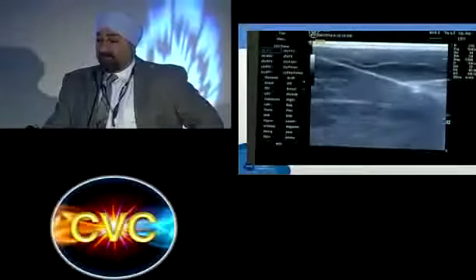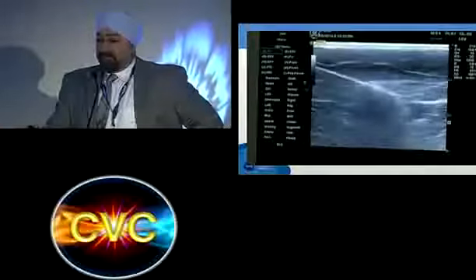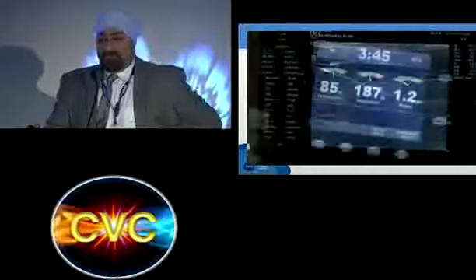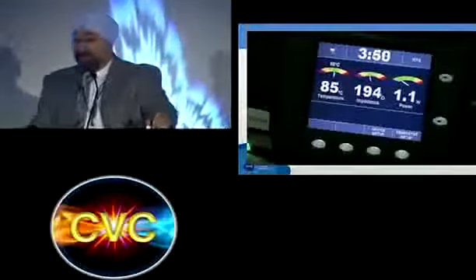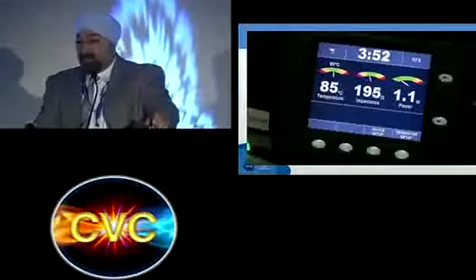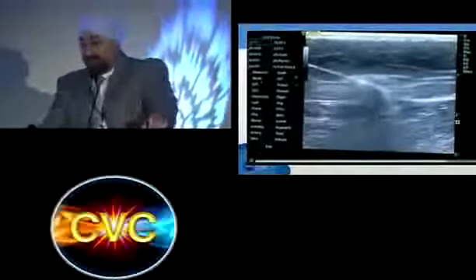Occasionally, if there are branches around it, I'll foam them at the same time, but not today. We'll just ablate this for now. You can stop there, please. So as you see, we're starting to reach just around 4 minutes here. And if you look at the ultrasound now, you'll see that the branch that we had before is definitely not.